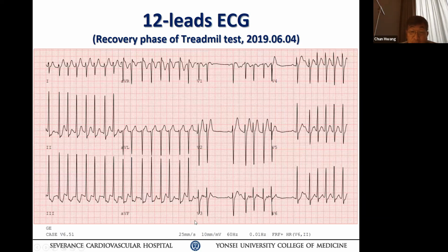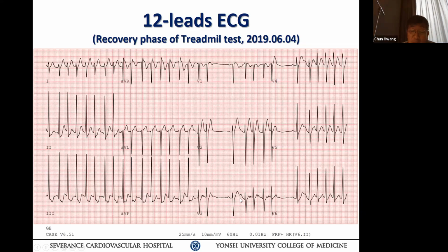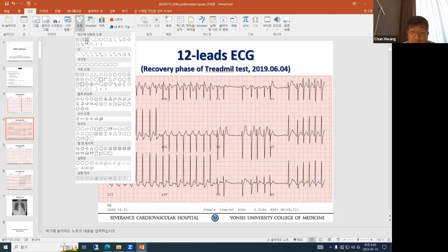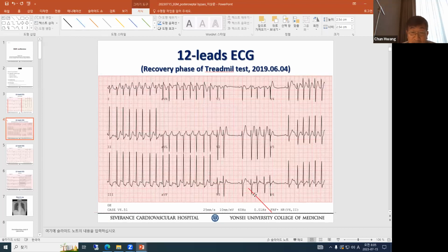Look at your RP of the tachycardia. 아니 거기 말고 그 다음 거. No. 사이너스, 그다음에 PAC, next P 보이지? T 웨이브에 notch 된 거. RP 해봤어 그거? Is that same? Or they are alternating, as I said. I think it's alternating. That's what I think. R to P.